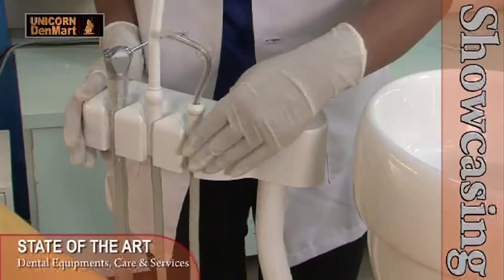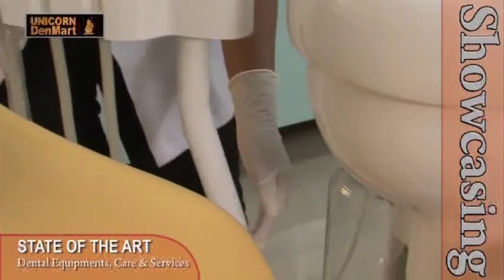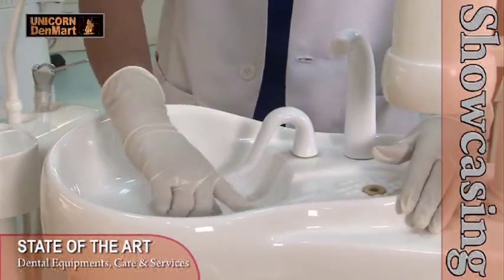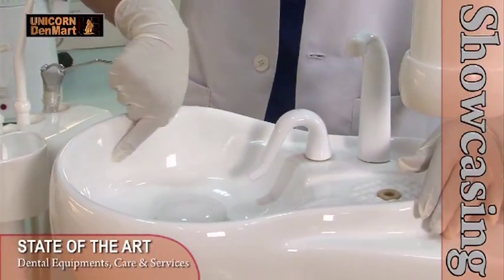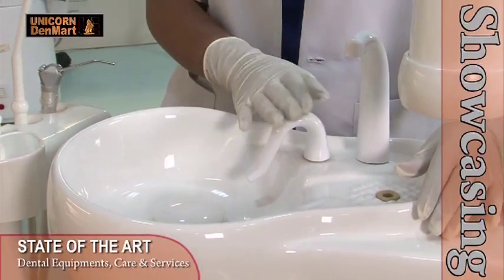Equipped with a water unit and assistant arm, this chair enhances the convenience of a user in delivering precise dental treatments. Coming with a wide and deep ceramic spittoon, which gets clean easily and contributes to the most sought-after hygiene in the dental clinics.